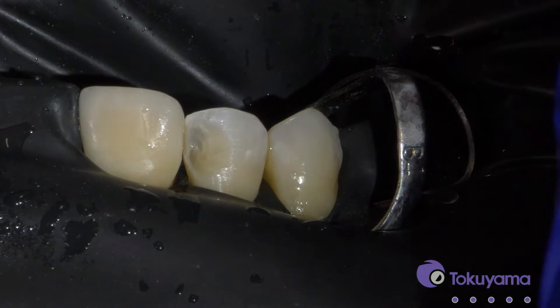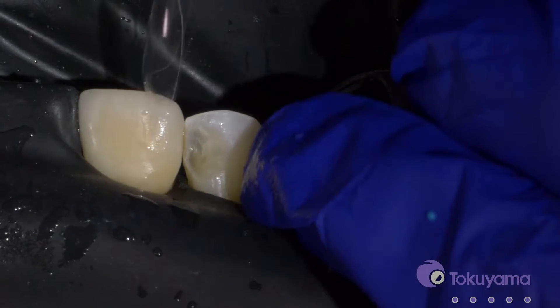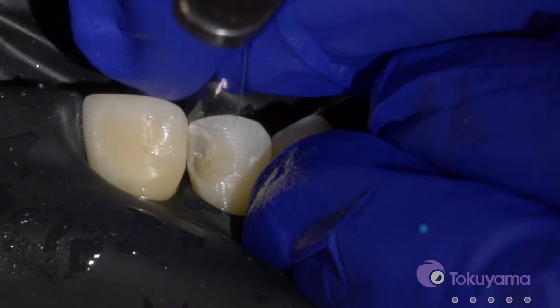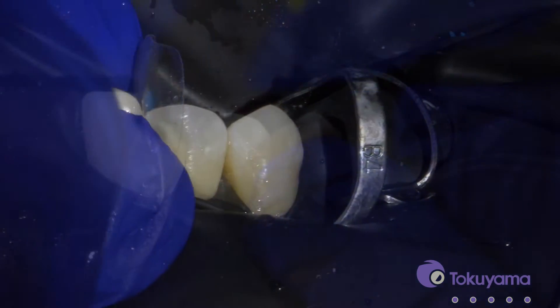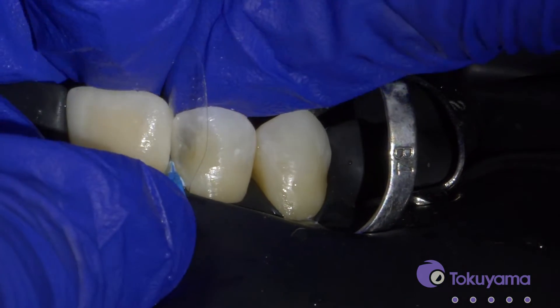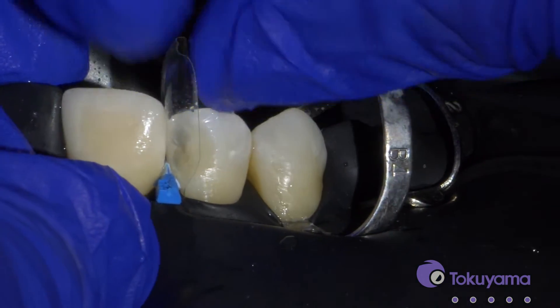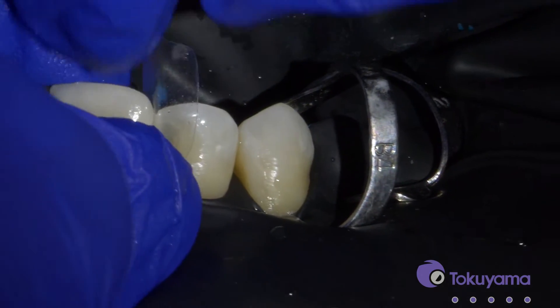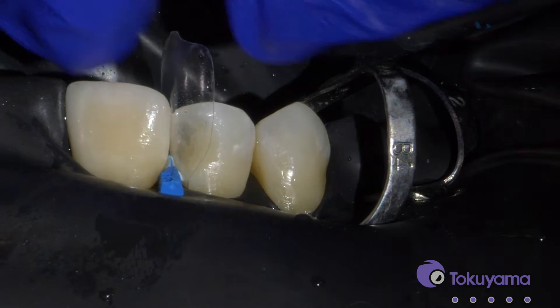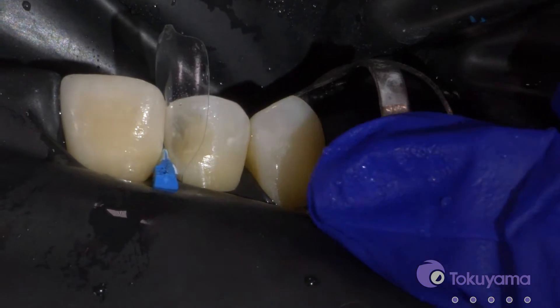Now that we have our restoration pretty much drilled out, we're going to put a matrix in. You can either use a curved mylar or just a regular mylar, whatever you prefer, depending on what your shape is. So we got that in place.